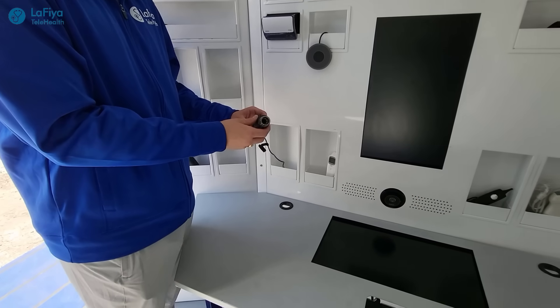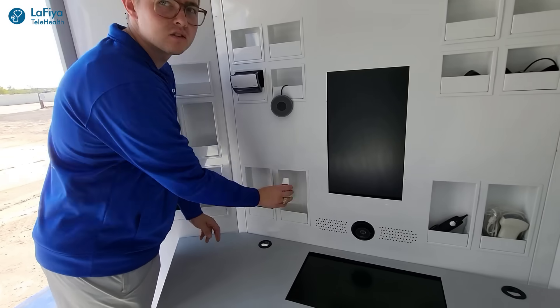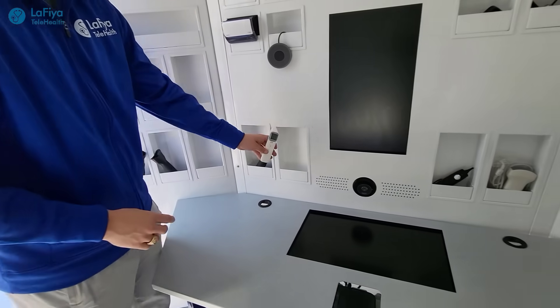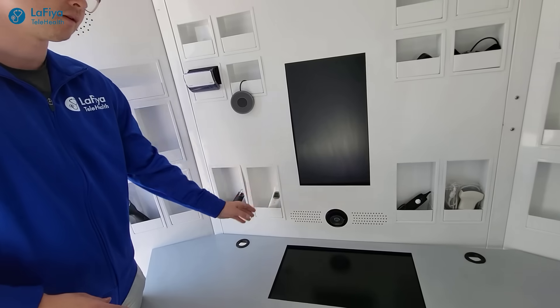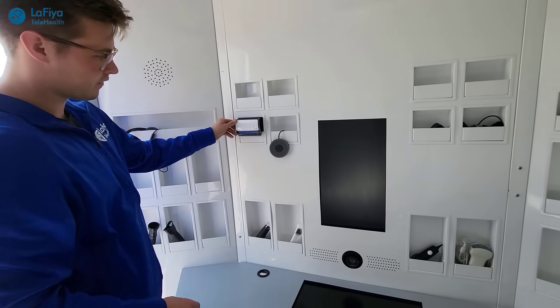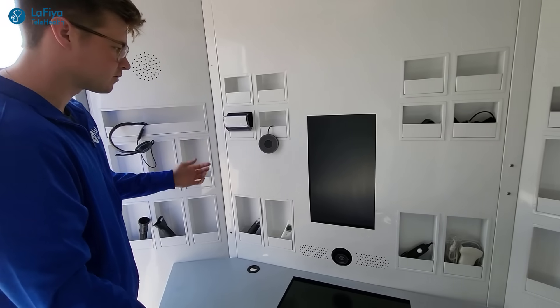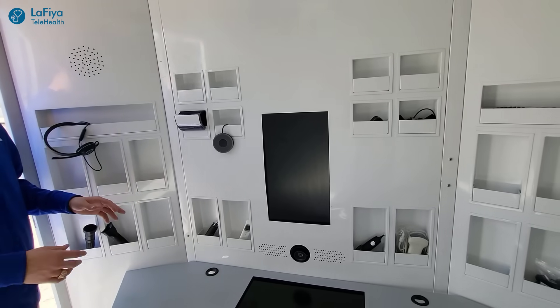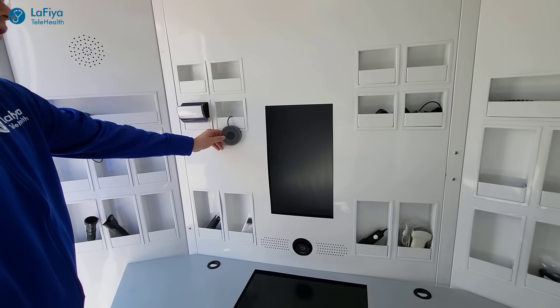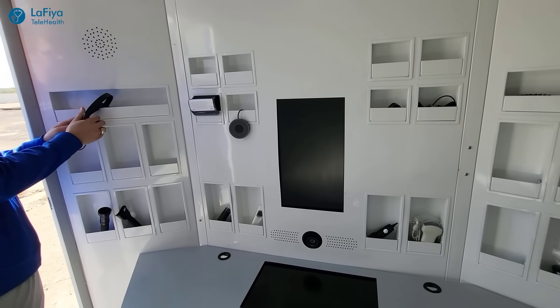This is a skin camera — the doctor will be able to see what is going on with the patient's skin. This is also a thermometer, which will allow the doctor to see the current temperature of the patient anywhere in the world. Next is blood pressure — the patient will put this on and the doctor is able to see their blood pressure. Here's the mic so that the doctor can clearly hear what the patient is saying during the visit.